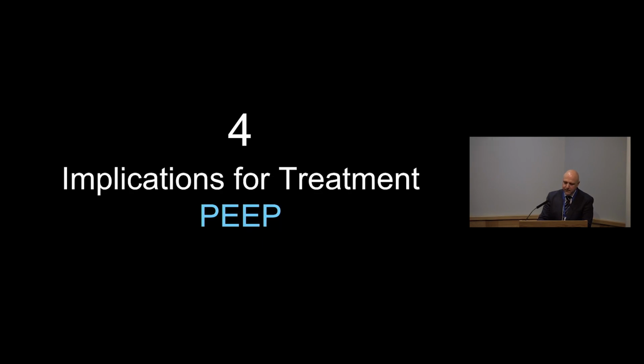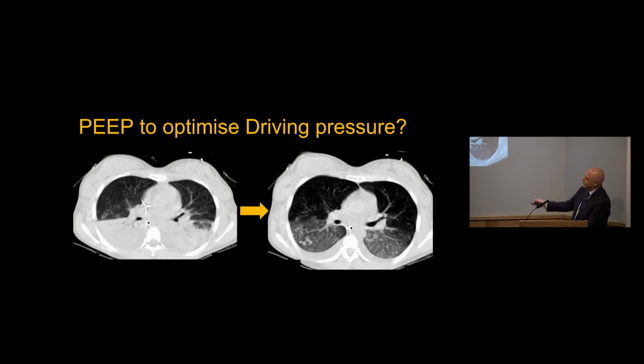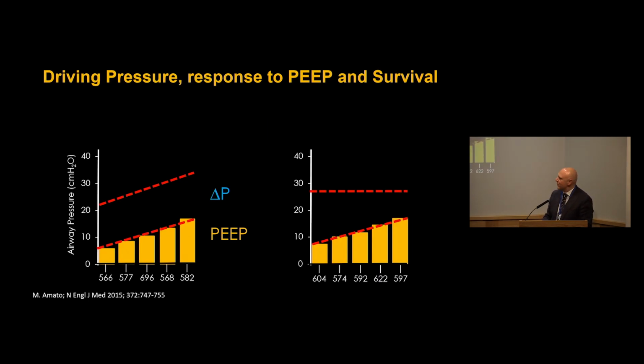PEEP. Well, one of the things we said earlier on, basically you've got patient A, you give a lot of PEEP, you transform into this one. Is it a good thing or a bad thing? So the idea was that you increase your PEEP level, you look at the driving pressure.